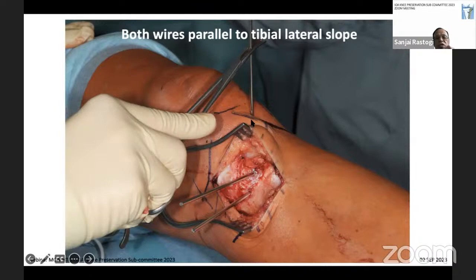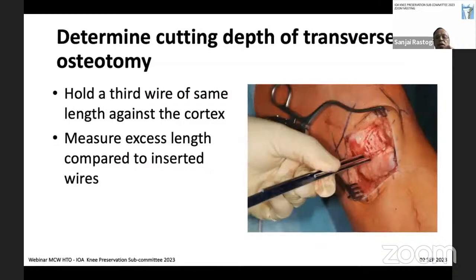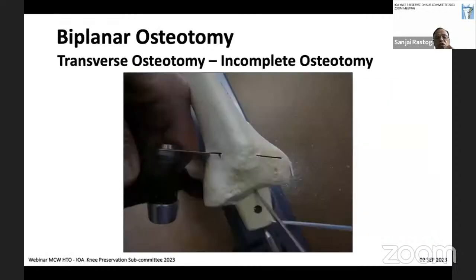This wire, which is 1 centimeter from the joint line, also helps to put the proximal end of the Tomofix in proper place. We hold the third wire outside these two protruding wires to know the depth of the osteotomy. This is measured and marked on the saw blade.